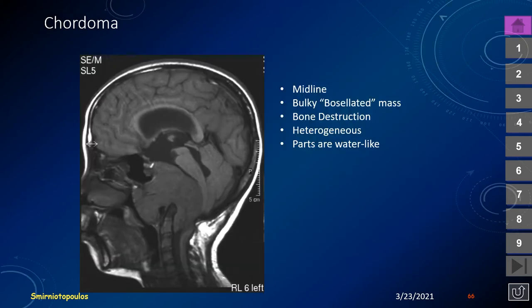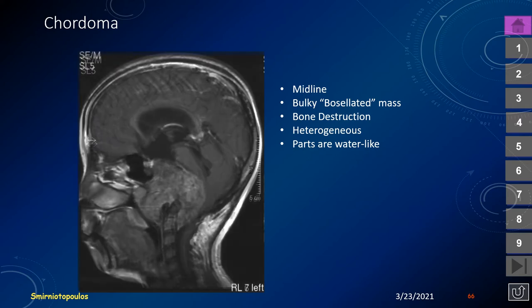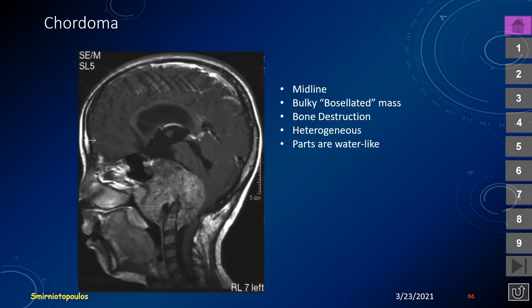This is another chordoma. The anterior arch of C1 and odontoid process are preserved, but there is a large lobulated mass extending both ventrally and posteriorly. Characteristics of chordoma include a midline origin in almost every case, a bulky lobulated mass, significant bone destruction, often heterogeneous signal, with many portions water-like in attenuation and signal intensity.